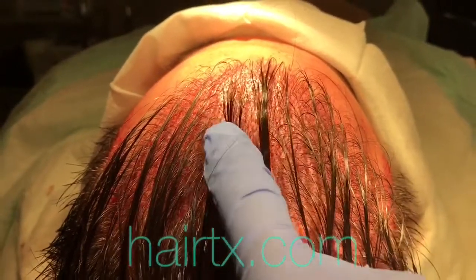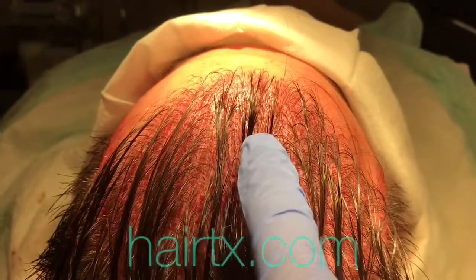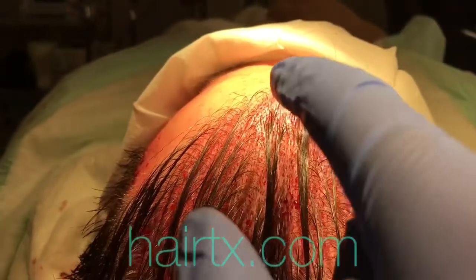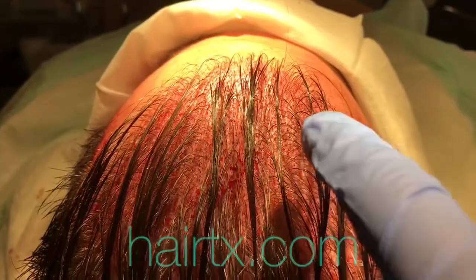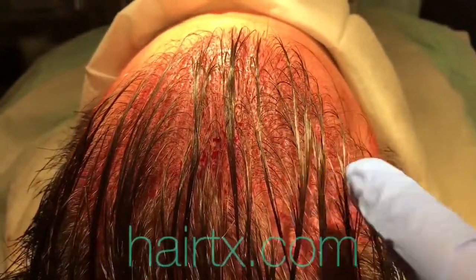The way I did this is really angle everything more properly low down, which is correct. Also, by camouflaging it, I went around the hairline, and all the 2-hair grafts that were exposed in the hairline I've now covered with 1-hair grafts. So I naturalized the hairline, made it much better. I've also created a lot better density here. It goes all the way through the central forelock, the frontal temporal recession.